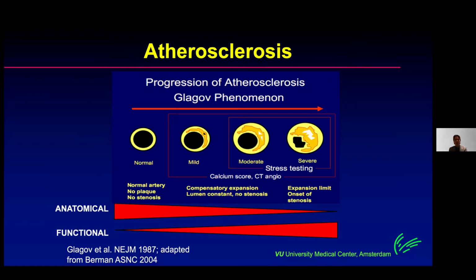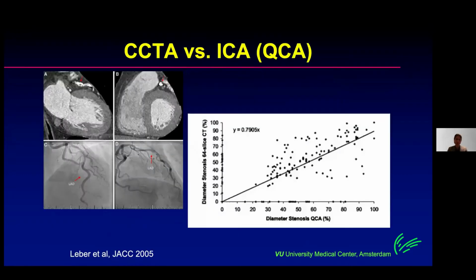So these imaging modalities are as complementary as they are competitive. So for which patient should you choose to go to the cath lab, and for what situation? This is a very difficult situation to be faced with in the outpatient clinic.